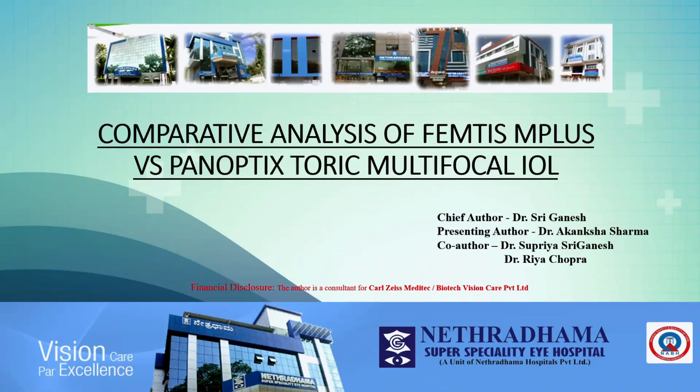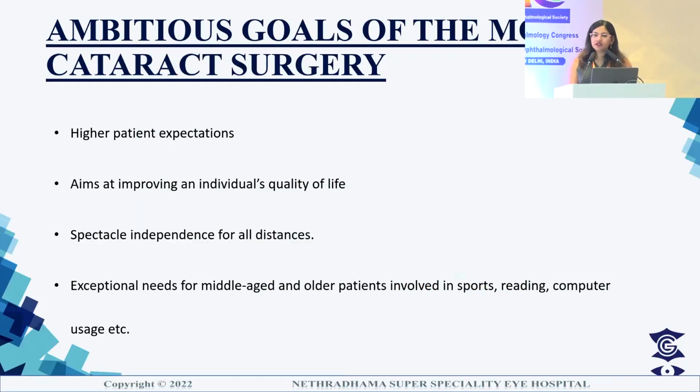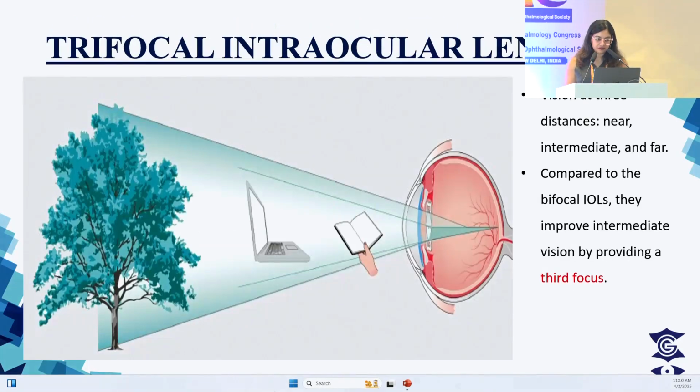Good morning, everyone. My topic for presentation is a comparative analysis of Femtis M+ versus the Panoptix toric multifocal IOL. Modern cataract surgery has evolved into a refractive procedure with the advent of intraocular lenses like the multifocal intraocular lenses, which promote spectacle independence by providing good vision at all distances.